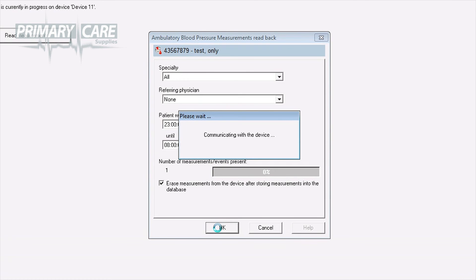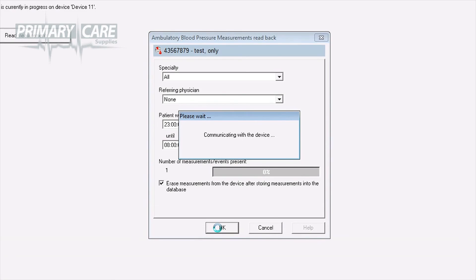The screen will display a message saying Ambulatory Blood Pressure Measurements Read Back. If the patient's number and name are correct, it also tells you how many measurements were taken during the 24 hours. Click OK. A download of 24 hours worth of data takes approximately 10 seconds, and once it's downloaded, the unit memory is cleared and it's ready for the next patient.